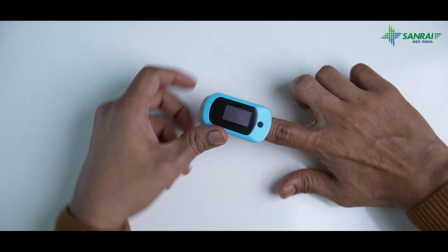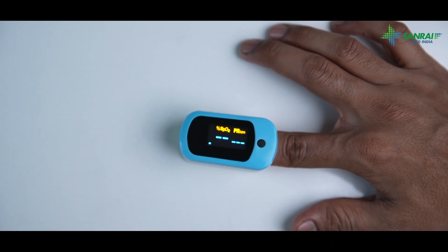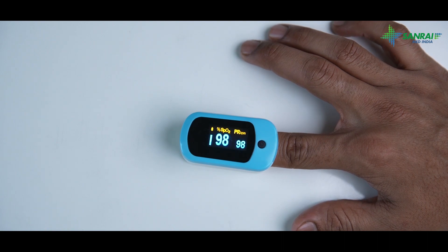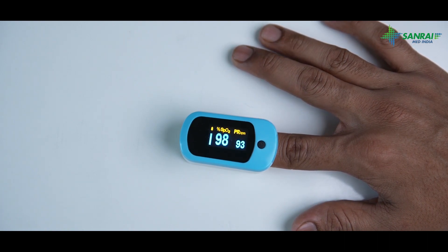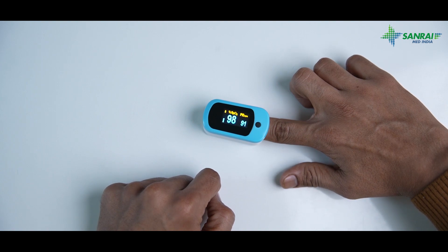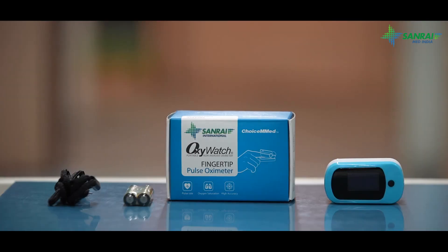Turn on the pulse oximeter and place your index or middle finger inside. Hold your finger inside the oximeter for a minute or longer until the reading is stable. Start recording from the baseline and monitor for three days at the same time. If your blood oxygen level is less than 92%, consult your doctor or visit the hospital.